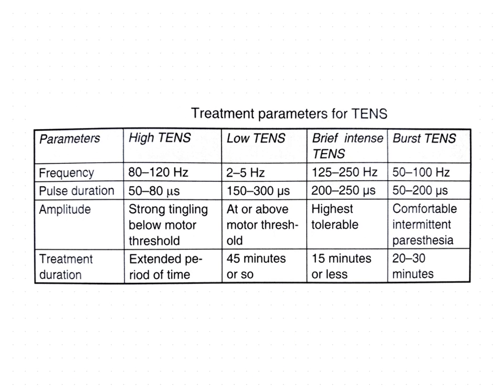Before we see the treatment parameters for TENS, there are several advantages of TENS. One is that it is non-invasive, portable, user-friendly and safe to use. It is used in long-standing pain syndromes, and it is much cheaper than the regular prescription of analgesics. Change of battery and electrode is the only extra cost once the machine is purchased. The precautions and contraindications are few, side effects are minimal, and it is non-addictive.